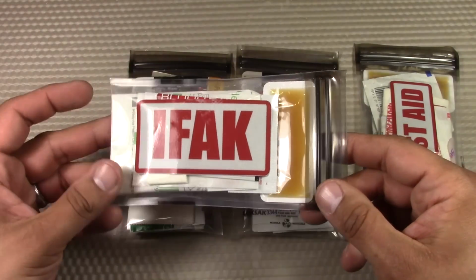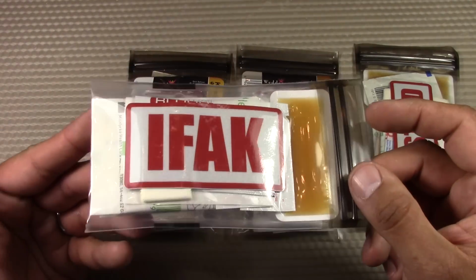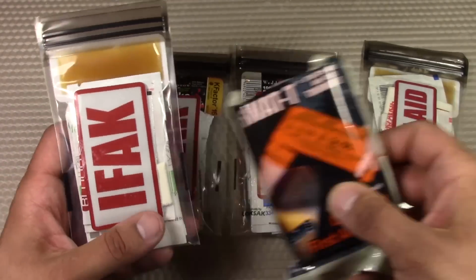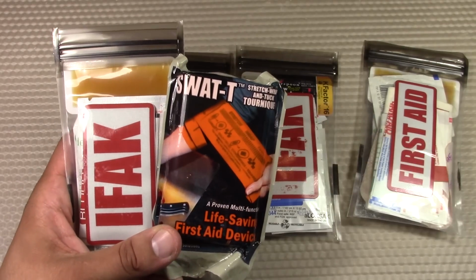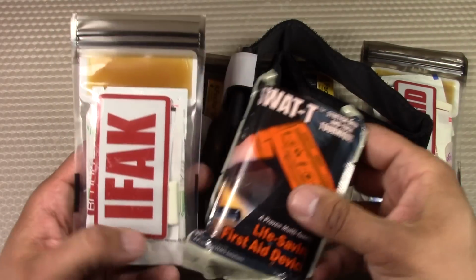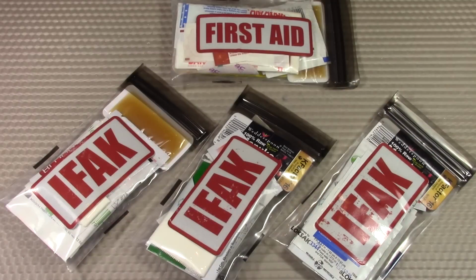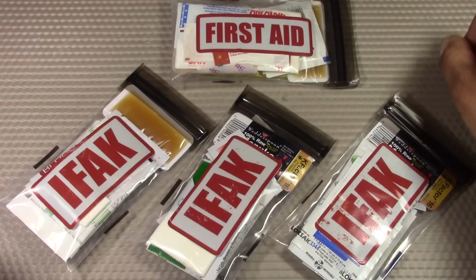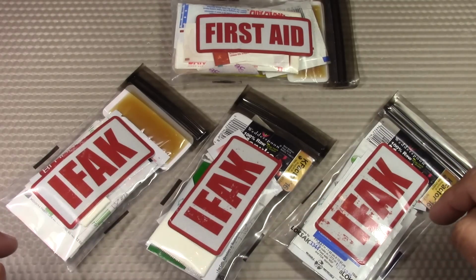Again, these are designed for everyday carry purposes, so to keep one of these in your pocket, for example, or in a backpack, maybe even combine it with a tourniquet, for example, for providing extra medical capabilities. And that might be a good setup for EDC purposes. That's going to do it for this video featuring the Mini Medi version 2.0. Again, we replicated that original first aid kit that we showed at the beginning of the video to 3 new ones, which I'll be giving away.